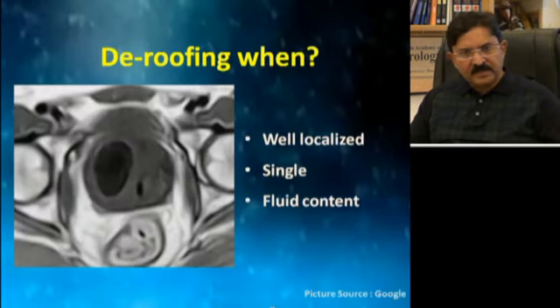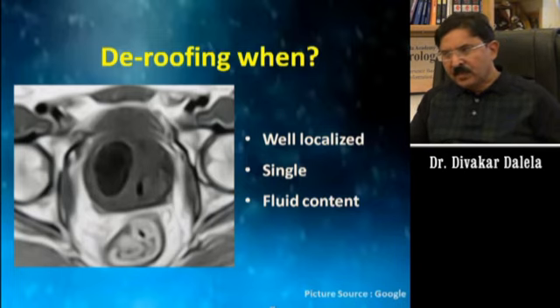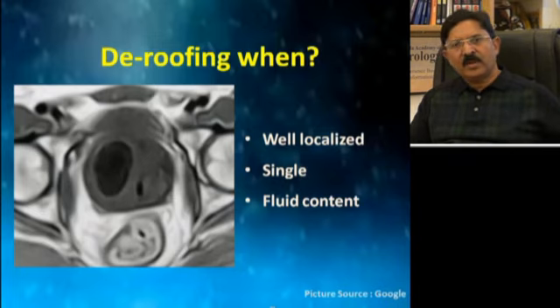How do you decide which one to do in which case? You do deroofing if you have an abscess of this kind, a well localized abscess, a single abscess, and the content is fluid. Now these abscesses are actually pre-existing prostatic cysts which got infected.